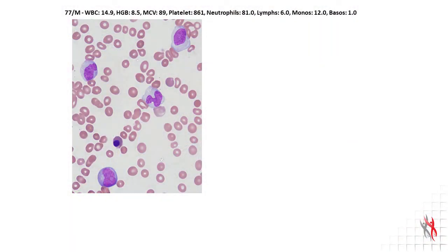Here I would like to show you an example of a CMML. This peripheral blood smear is from a 77-year-old man who presented with leukocytosis of 14,900 white blood cells, anemia with a hemoglobin of 8.5, and an elevated platelet count of 861,000. The percentage of monocytes is 12%. As a hematopathologist, I would recognize the presence of immature and atypical monocytes.